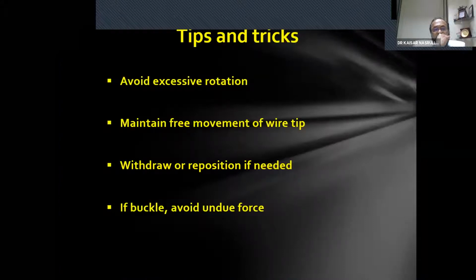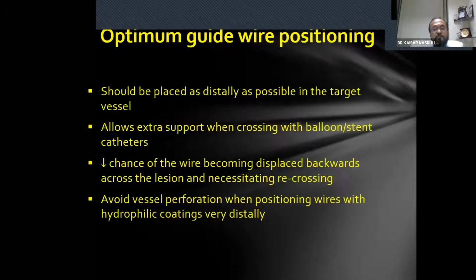Tips and tricks: avoid excessive rotation of the wire, maintain free movement of the wire tip. Remember, free movement, don't push it. If there is a channel, it will go smoothly. Withdraw or reposition if needed. If the wire buckles, avoid undue force, withdraw, change the tip of the wire in another direction, and then move forward.